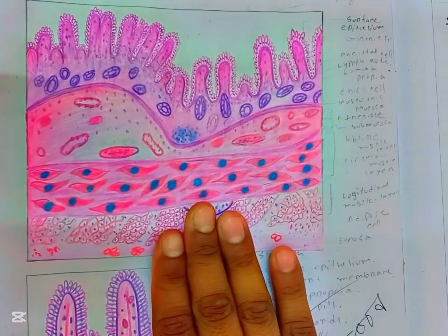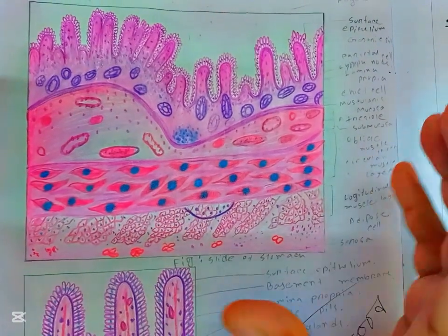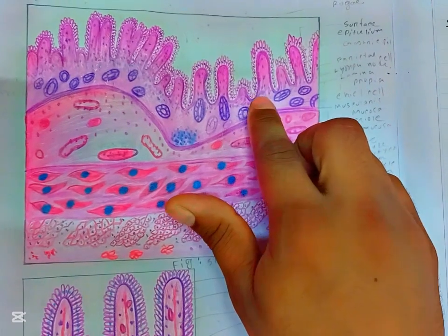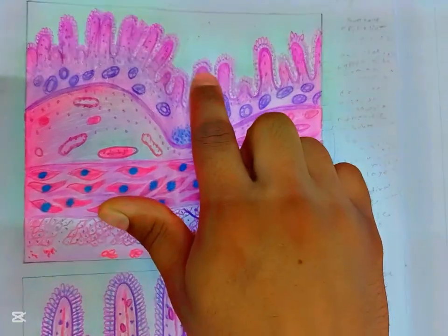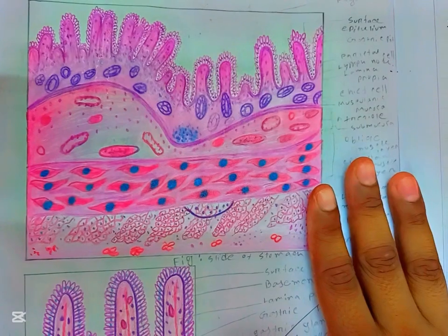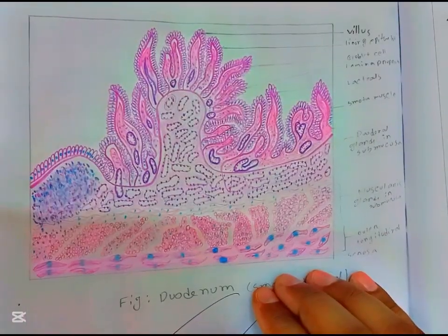This is the histological figure of stomach. How can you identify it in the microscope? You can easily identify it by seeing the gastric pits and mucosal folds of the stomach. These are called rugae. That's all about stomach. Then now the small intestine.